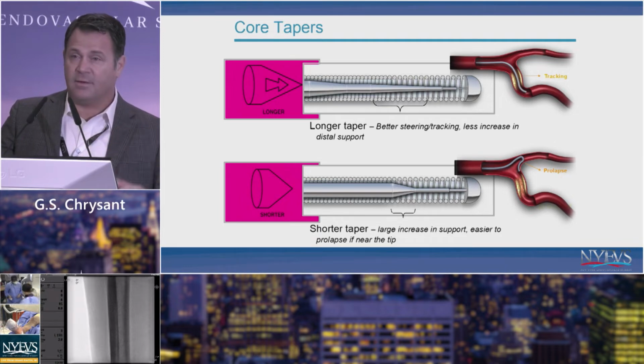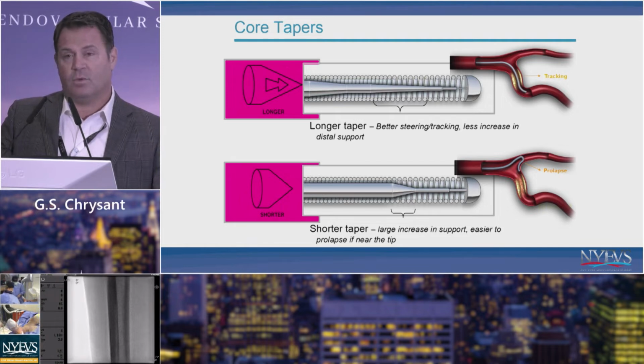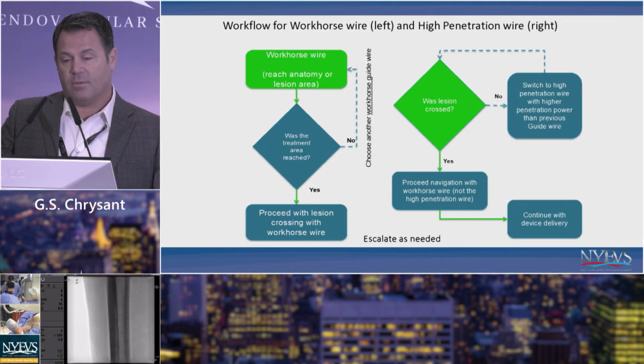That's just fitting your wire to your lesion. Sometimes it's more important to be able to track, and sometimes it's more important to cross. And so choosing your tips and choosing your wires can be very important there.